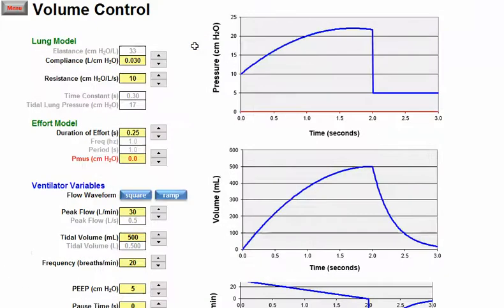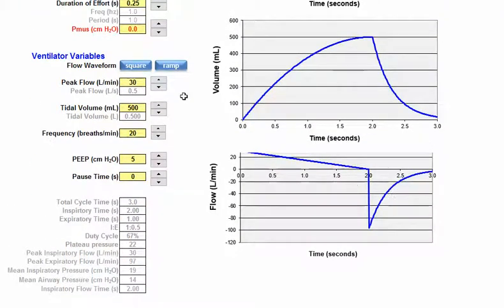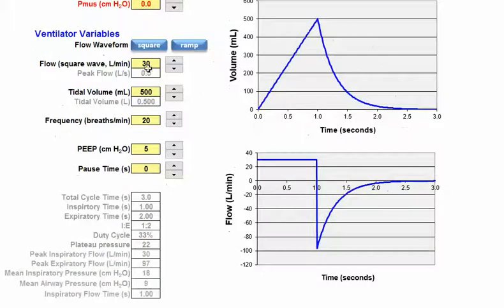So I'm going to switch this to a ramp or decelerating flow. I'm going to scroll down to my page and you notice I have a decelerating flow now and my peak flow is 30. That's where I was before. However, you notice my inspiratory time is two seconds.